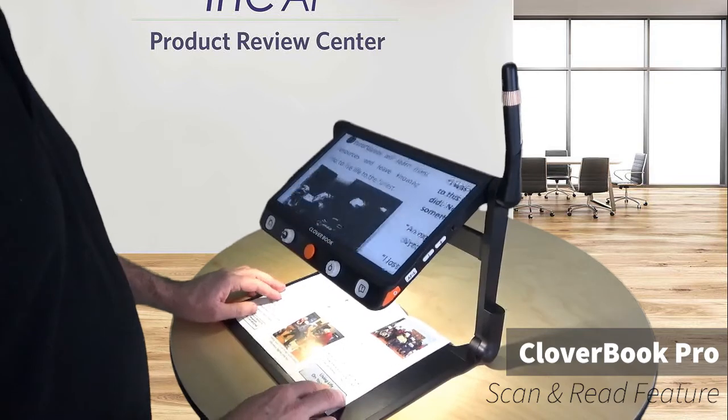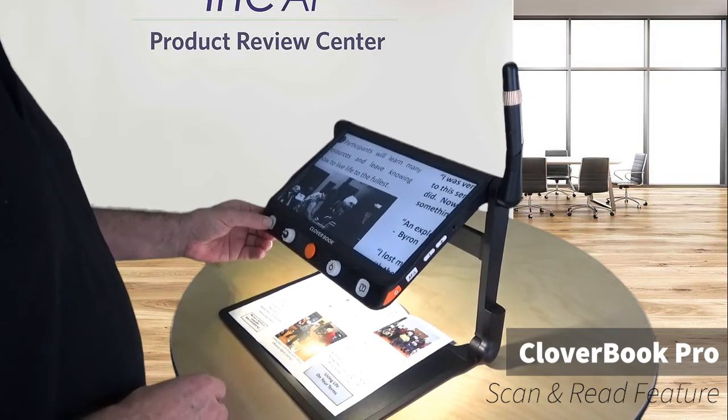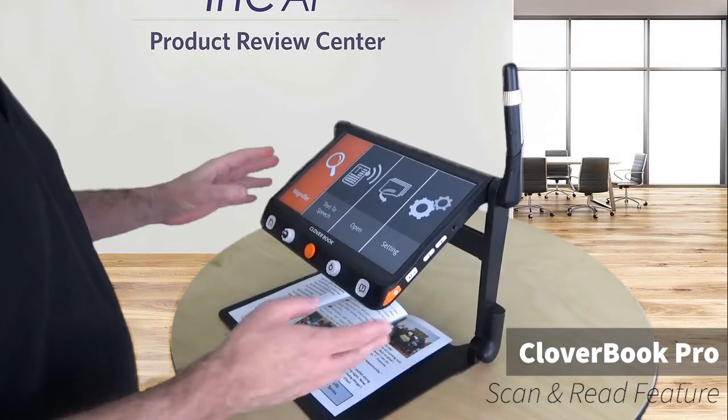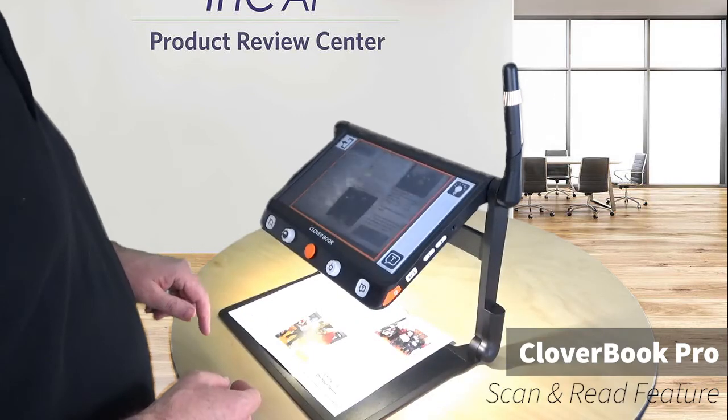Now if I have something where I want to do the entire document, so let's say this entire letter page document I want to have read back to me, I can go into the scanning mode. I'm going to hold down the home button. I'm going to bring up some options here, one of which is text to speech. I'll tap on text to speech.